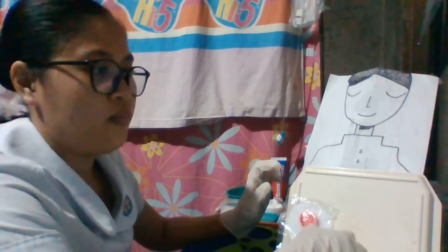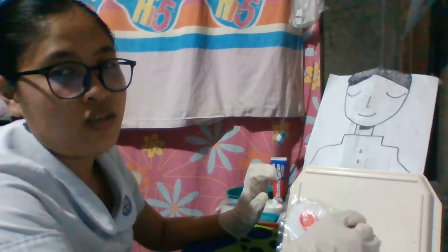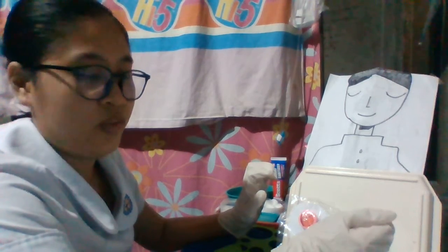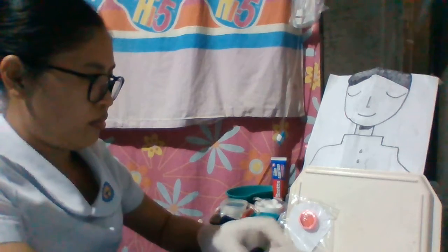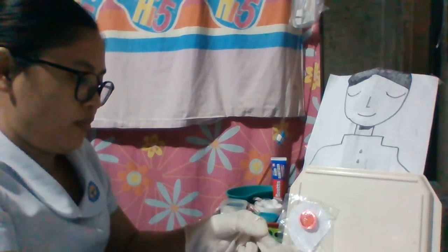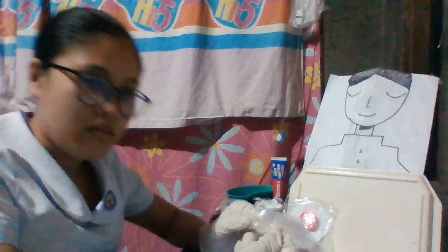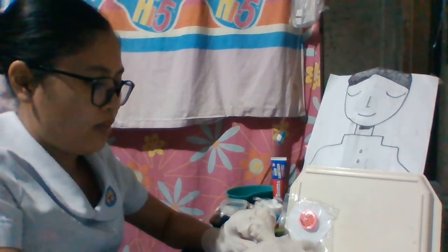Using tape may be optional, but some are not. It depends on the agency or the manufacturer. Then fold the bottom edge of the pouch over to fit the clamp, and secure the clamp.